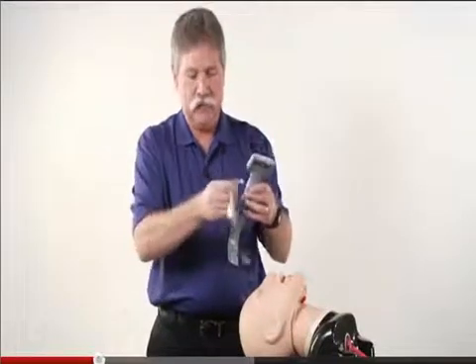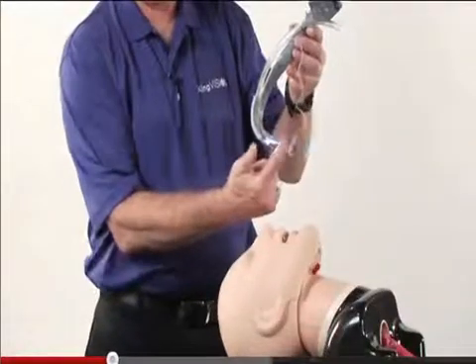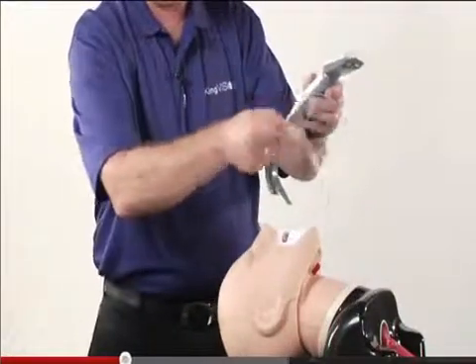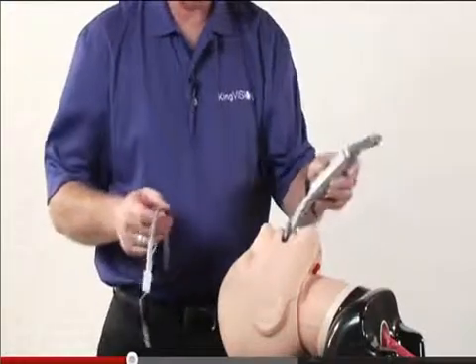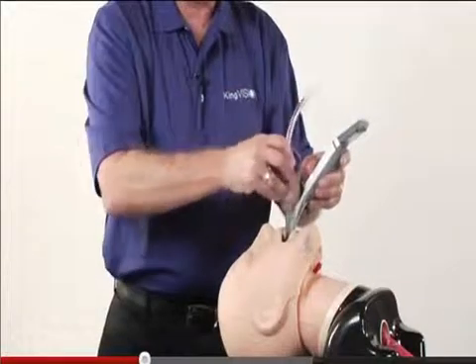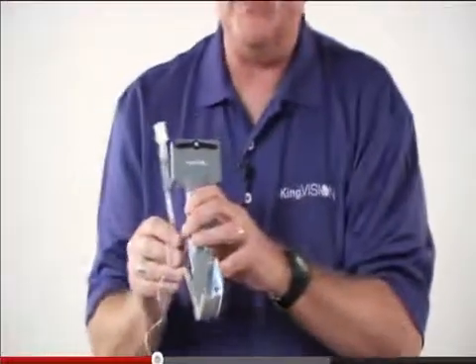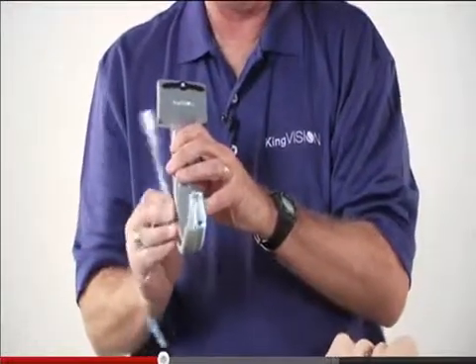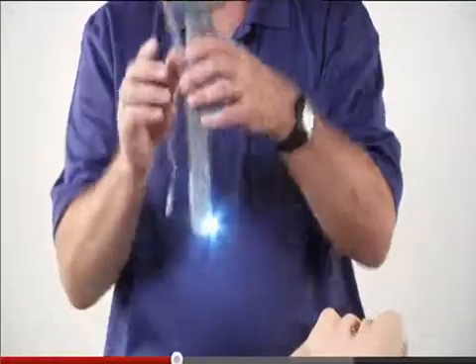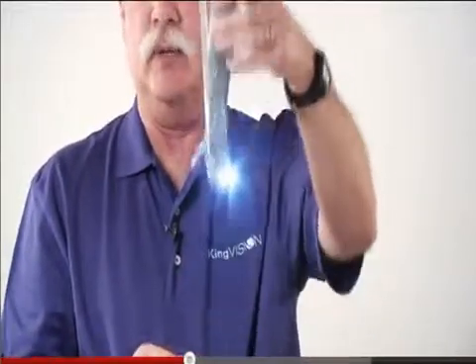Now, some folks prefer to preload the tube into the channel with the tip right at the end here, as opposed to the end of the blade, before introducing it. Others, to avoid this getting into the field, prefer to advance the channel separately, and then advance the tube into the channel and into position. Either way is acceptable. It's also important to note that within the channel, you can twist the tube to gain a little bit of lateral control, and obviously, to get additional anterior, you can actually lift with the blade itself.